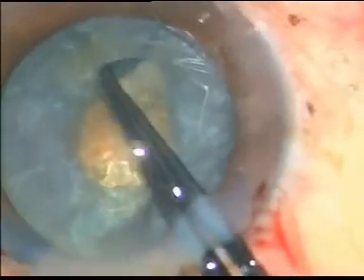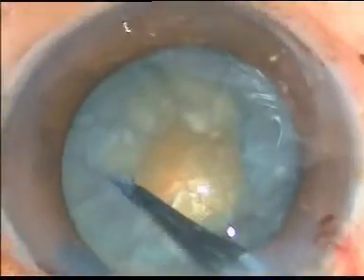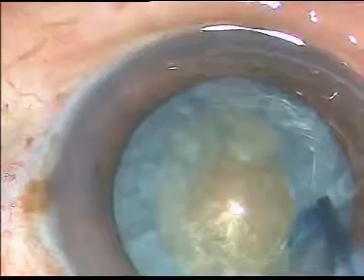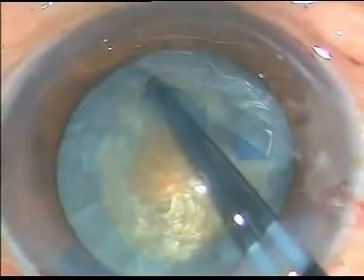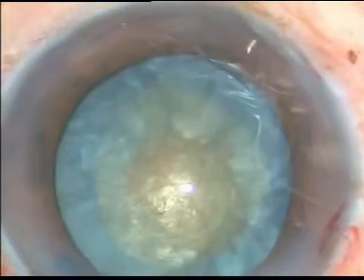Now I hold the capsule with the help of a capsule holding forceps and I make an optimum sized capsulorhexis. Thank you very much for watching.